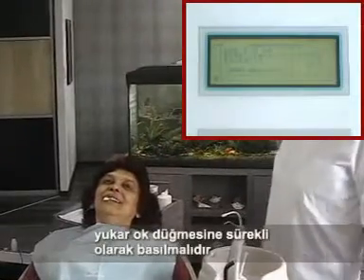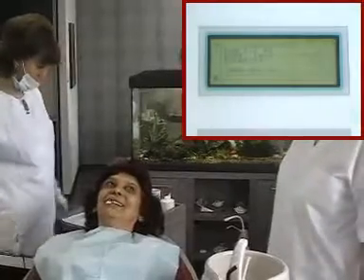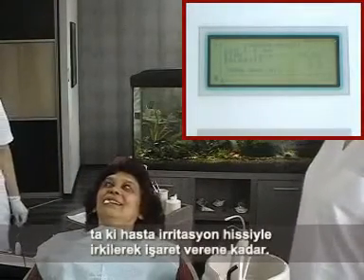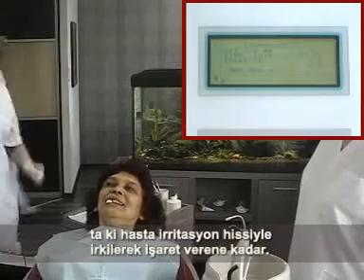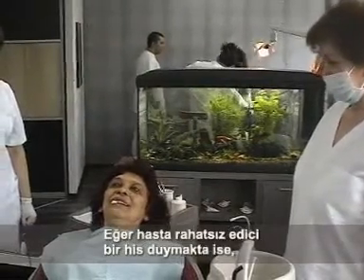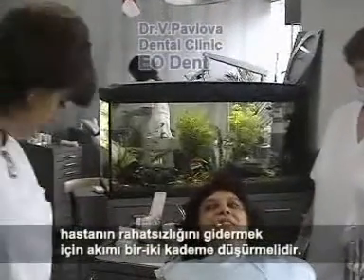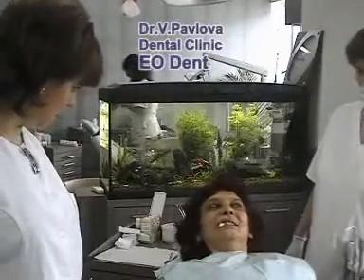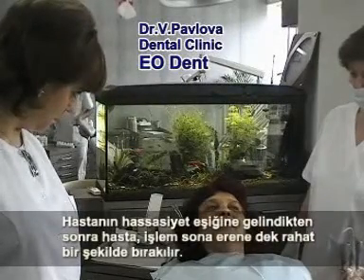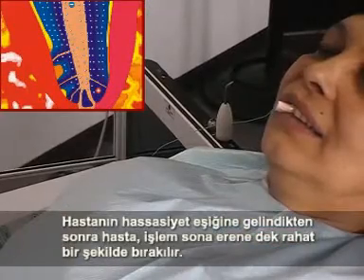The button is held pressed until reaching such a current level at which the patient starts feeling a sense of shivering and shows this by a sign agreed in advance. In case of unpleasant shivering, the dentist must reduce the patient's current by 1 or 2 stages. After the real threshold determination, the patient must be left alone until procedure termination.